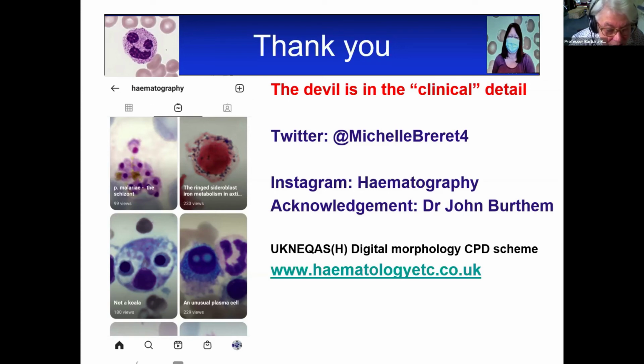And you only see that, in my experience, in burns, because it's budding off not only things that are spherocytic, but things that have got enough membrane that they can then turn into a tiny little disc. So I think if you get a film like that, it's worth looking for a microdiscocyte as well. Thank you for letting me comment.